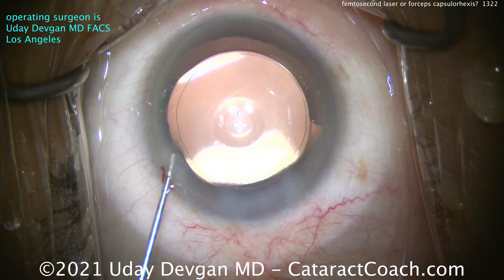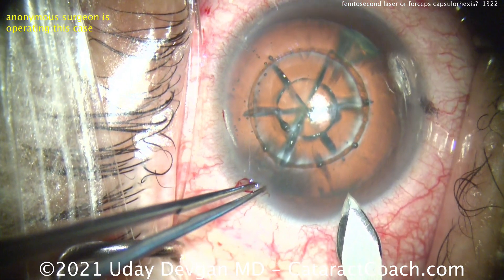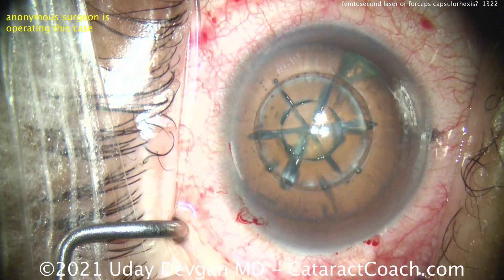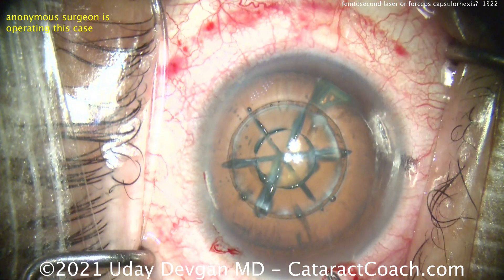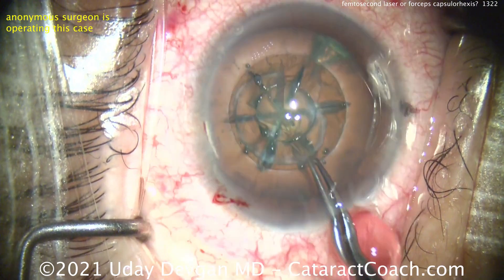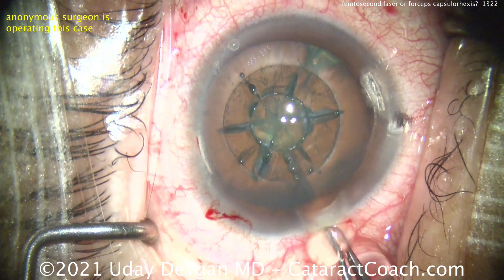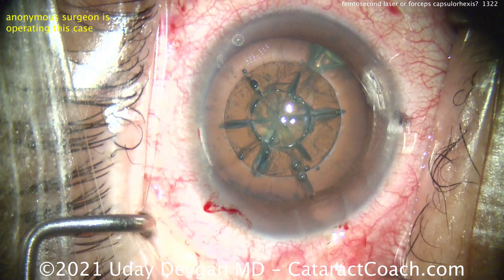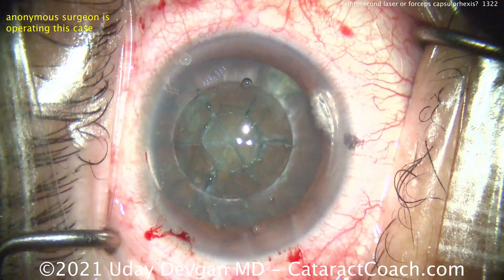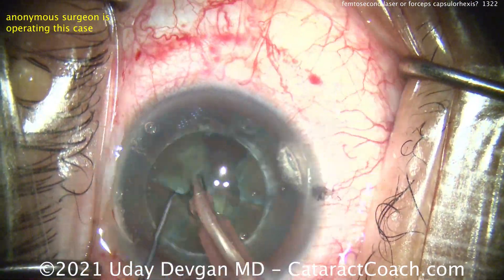Now let's skip over to watching a femto case. Here's an anonymous surgeon operating — look at that incision being made with a steel keratome. Even the steel blade is better than the femtosecond laser for making an incision. There's the capsulotomy — it's already done. You can see the round opening there, and the lens nucleus already has those sextant pieces broken up and can be removed. Let's fast forward this.